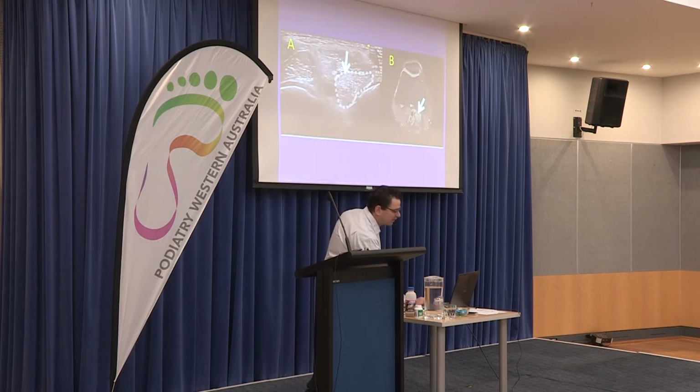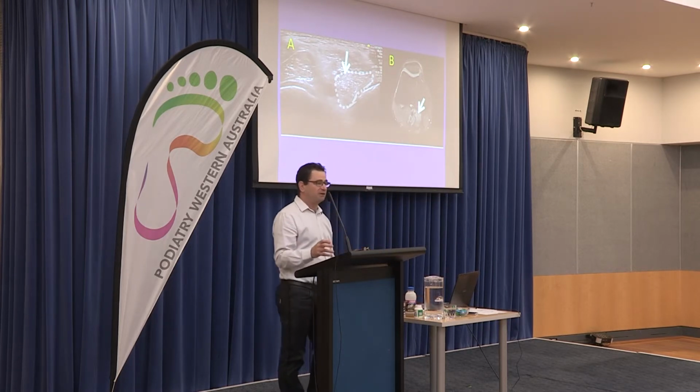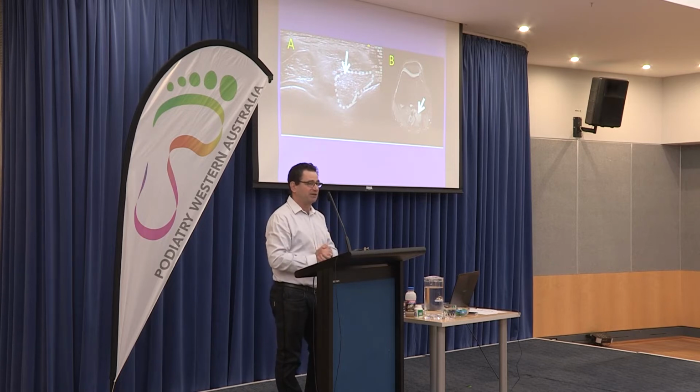The slight downside, unfortunately, is this is the medial head of gastrocnemius. This time we're looking cross-sectionally. That's the medial popliteal fossa, that's lateral gastrocnemius, medial gastrocnemius. You can see how that echogenic change is from denervation change. You can see on the corresponding MR, this brightness in the medial gastrocnemius is from where the muscle is poisoned. You can obviously see that's the vein, that's the artery. You can see how they can come quite close to it. So hypertrophied muscles that get really big in exercise can actually narrow the artery down.